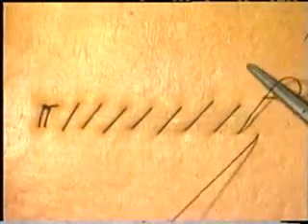After the final suture has been inserted, leave one loop long and then ligate using a standard reef knot technique. Once this has been tied, you're in a position to cut both ends of the suture material.